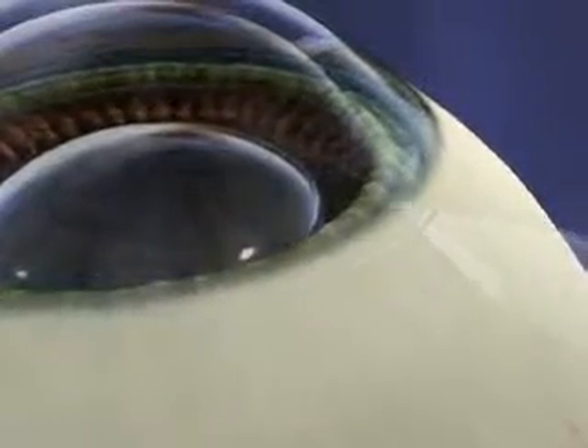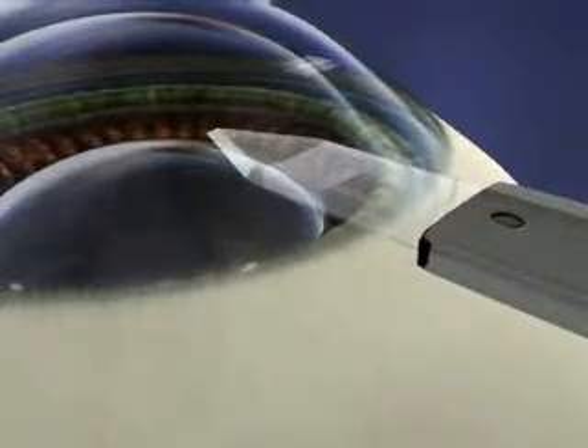Following placement of the gel, a small incision will be made, through which the lens will be inserted.